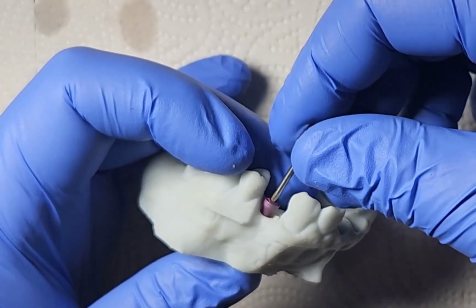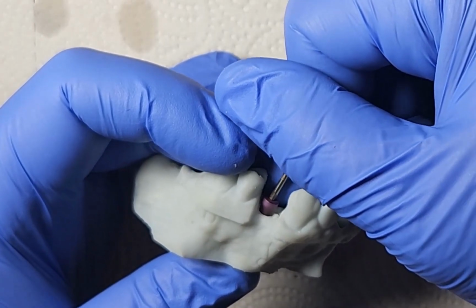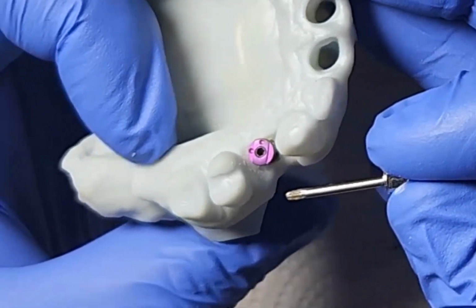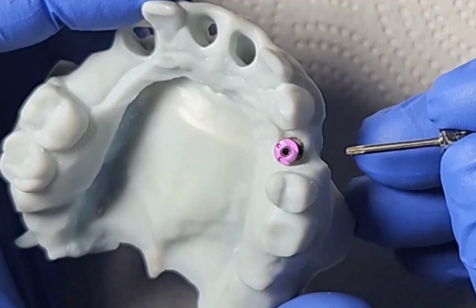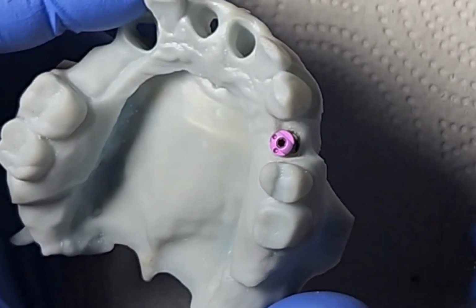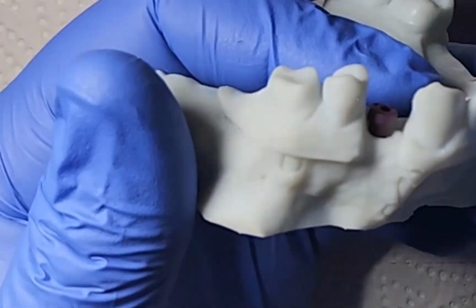And so what's great about this is that now, let's say that it's been 3 months and the patient's all healed, and now we're ready to do the restoration. Well, I don't have to go and remove a healing abutment, put in a scan post and all this. This is the scan post, all right? So there's geography on the top of this that the scanner picks up, and that's all built into the Exocad library. So you don't have to go removing components, messing up that soft tissue attachment.